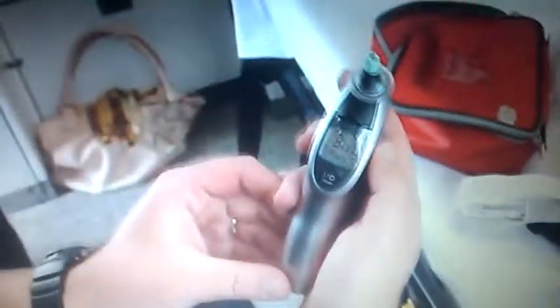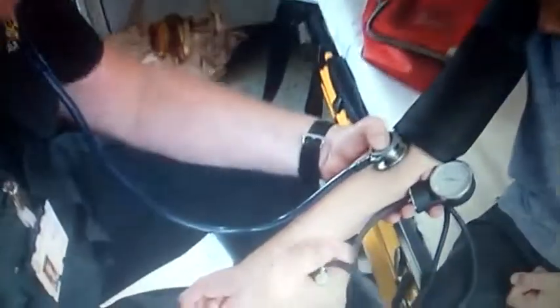We have lots of different medications, and we have various bags of medications, and they're coloured, and we know what's in the medication bag. And these treat everything you could ever imagine, from a minor headache right through to someone who's bleeding very, very heavily. We have drugs to actually help us deal with that person. We also have a main observation pouch, and in this is what we use to take your basic observations like your temperature, your pulse, your blood pressure, and your sugar levels. Other things we have are fluids, when people lose a lot of blood or are dehydrated, and blankets when people are very, very cold. And when the ambulance comes back at the end of the day, everything that we use on the ambulance is replaced so that we can go out again to the next person and the ambulance is fully kitted like it was at the start of the shift.